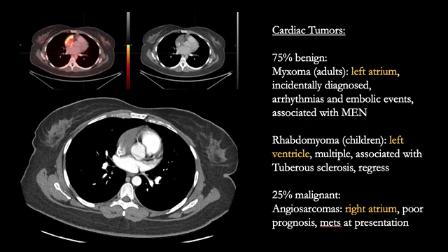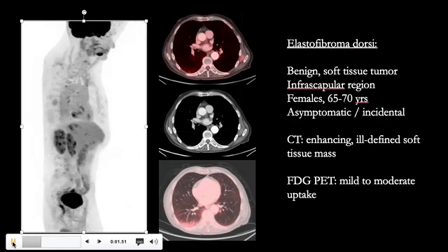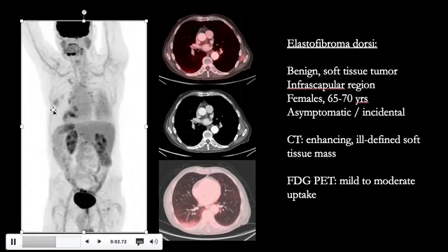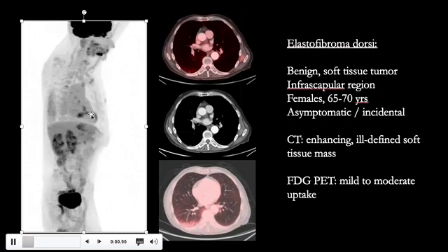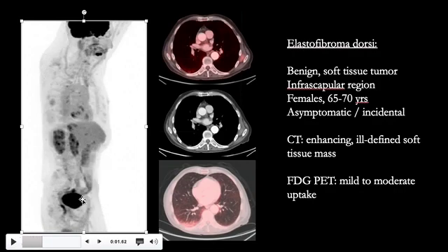Here is a companion case, another benign tumor which shows mild FDG uptake. Let's start by looking at the rotating image. In the left lower chest wall, there is this focus of FDG uptake and in the right lung there is diffuse FDG uptake. The infrascapular region is the site of a characteristic tumor called elastofibroma dorsi, and we see a hypermetabolic focus here which shows contrast enhancement on the CT component of the PET CT, which was performed with IV contrast. There is also diffuse mild uptake in the right lower lobe atelectasis.